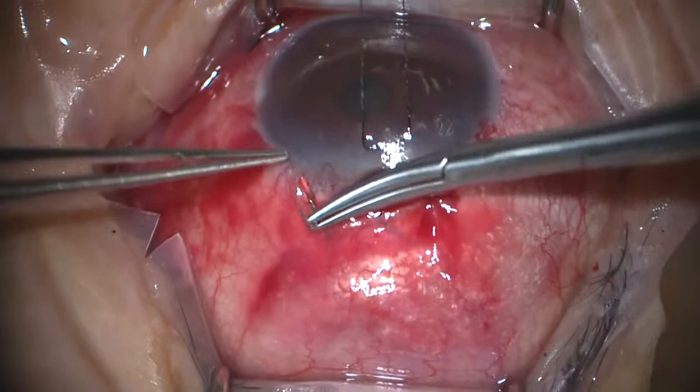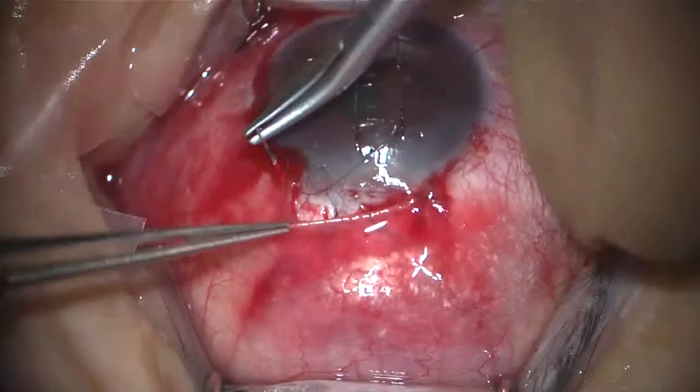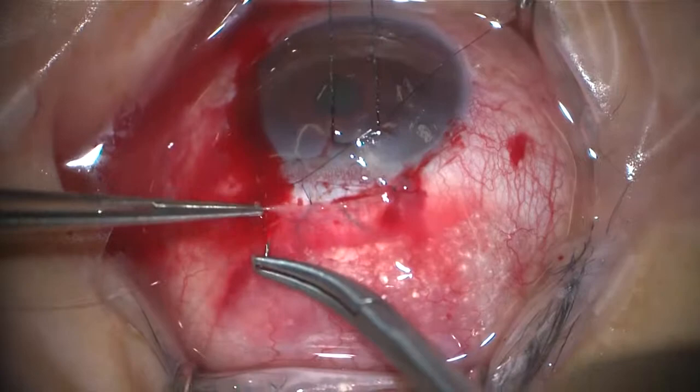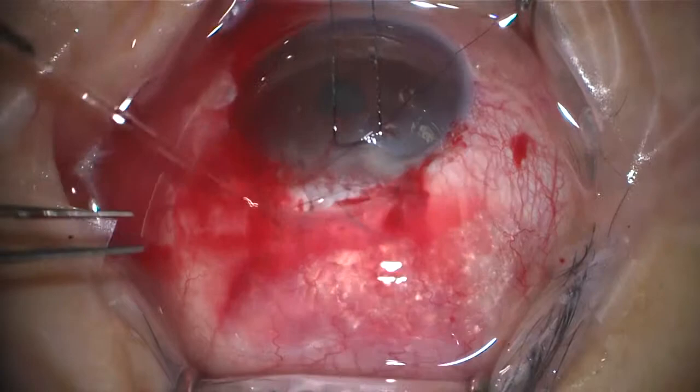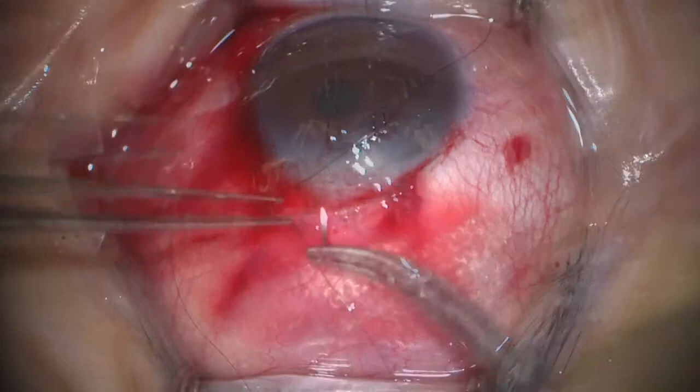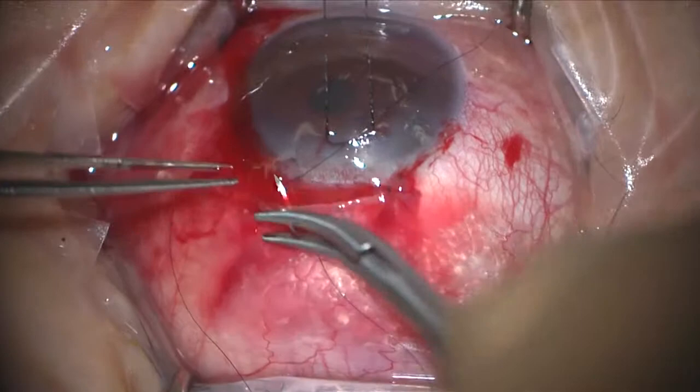Good. So to the nasal side now, so nice bite of the sclera, outside to in on the conjunctiva, inside to out. So I'm pulling that so I've got a nice, tight, watertight conjunctiva at the limbus.